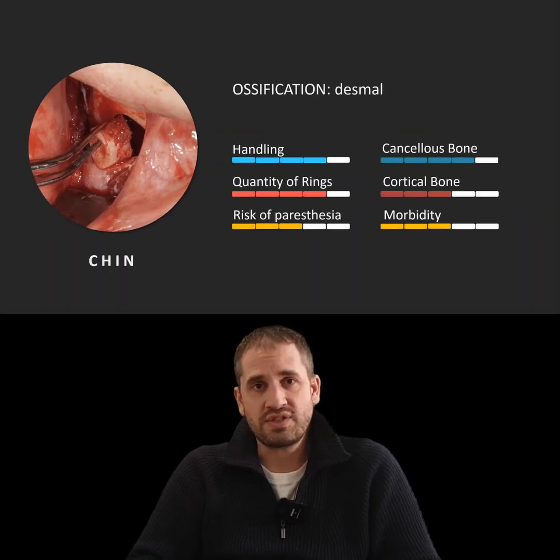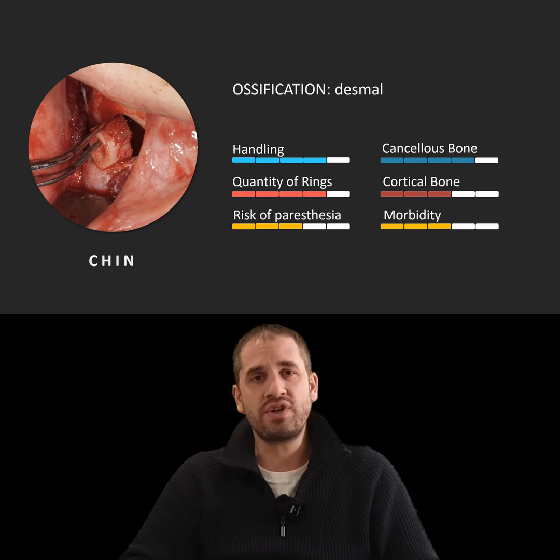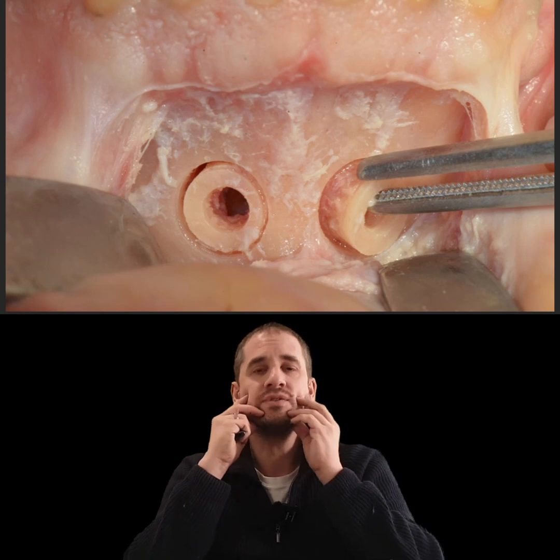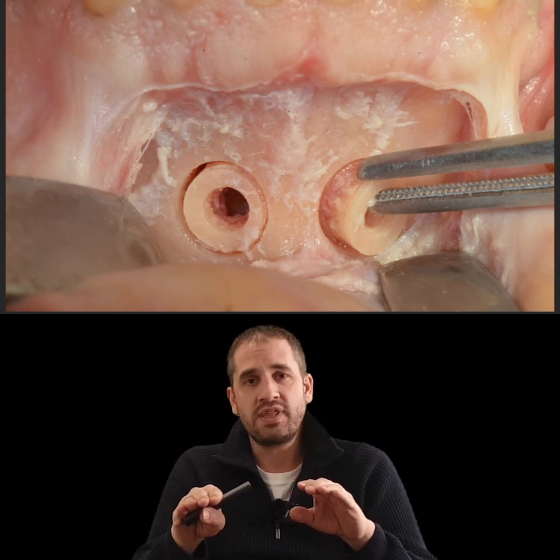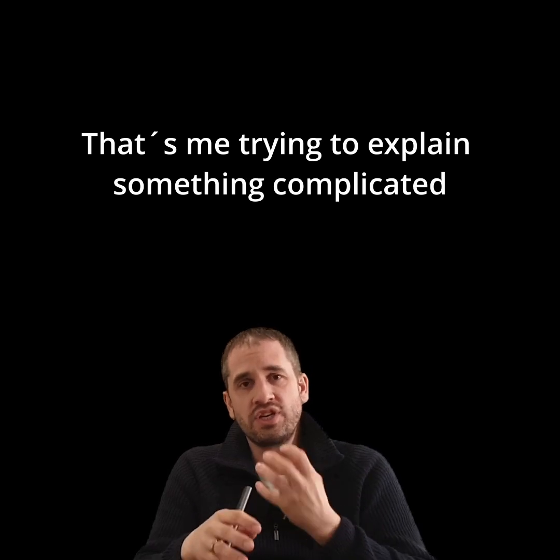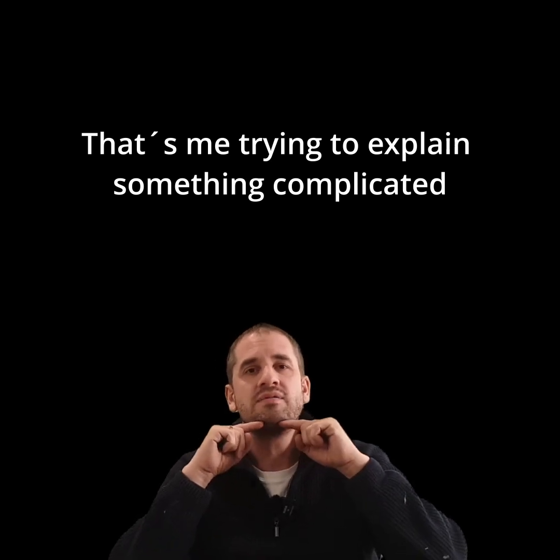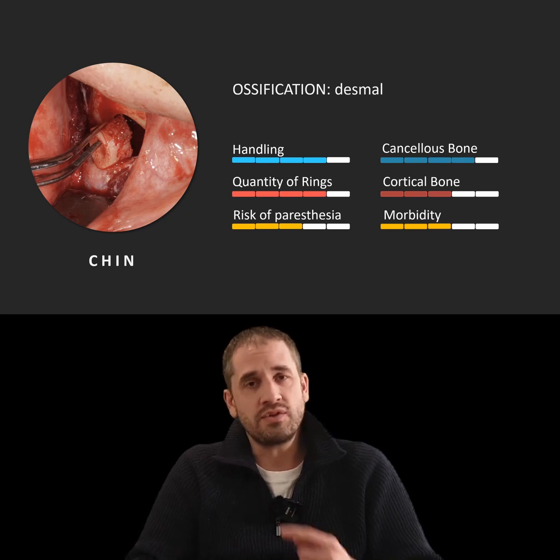The next slide shows the bone ring from the chin. I would say if you want to start to harvest bone rings, then start with bone rings from the chin. Because the patient can close the mouth — you just have to pull the lip a little bit down, then do the cut in the right way. If you do it the right way, there's no problem of any chin drop or anything like that.